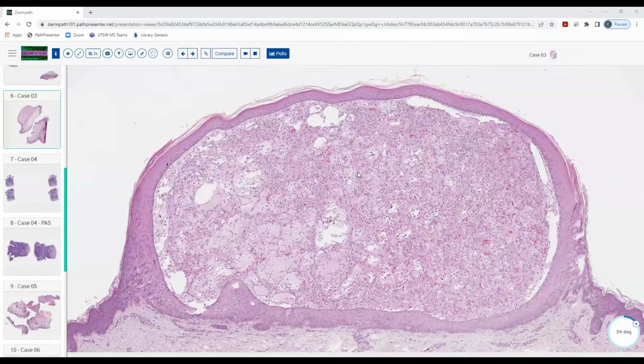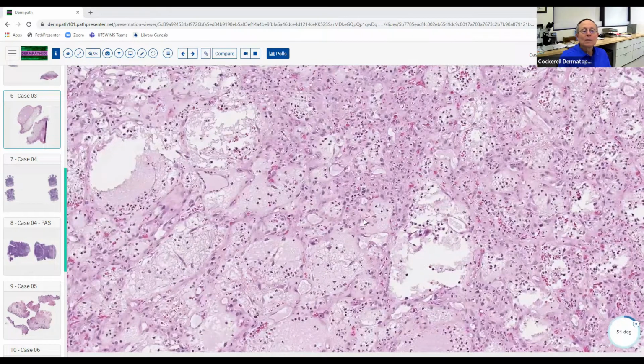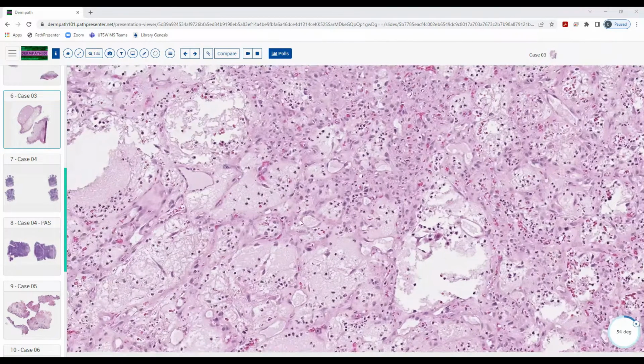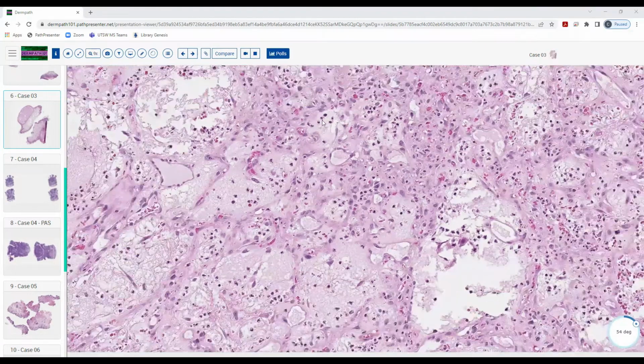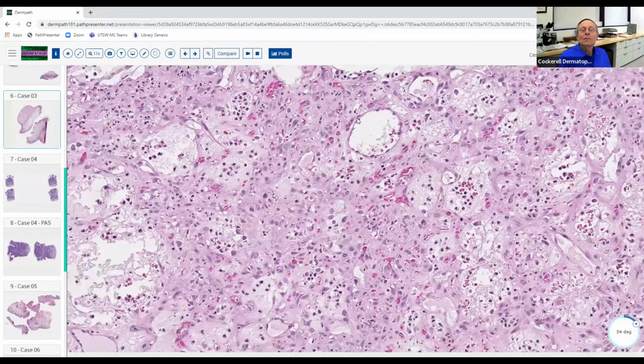It almost looks like there's, I don't know if that's mucin or if it's like this reticular sort of substance. A lot of this is sort of just like sweat even. Well, it's probably, some of this is probably some serum and maybe some fibromucinous kind of stroma here. And then what about all these other areas up here? What are these cells here?